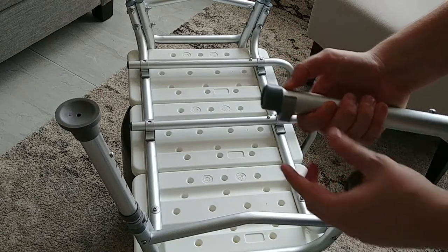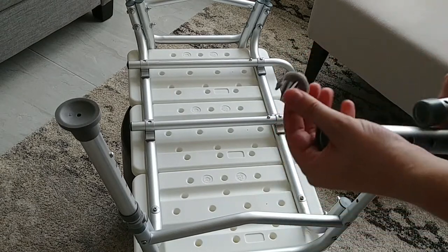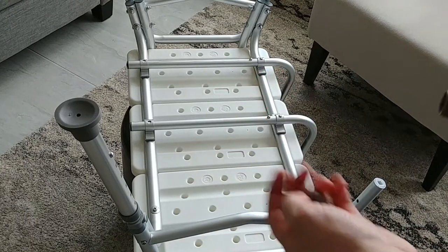Give that a little press. That collar pops off. And there's the locking pin.